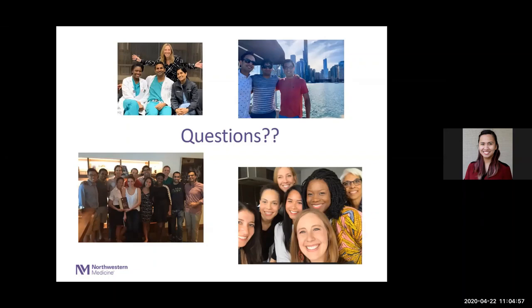And a couple of questions involved defining certain numbers and values, which is always a little bit tricky. One of them was, what do you define as urinary retention on urodynamics? And is that different for men and women? Well, in my mind, there's a difference between incomplete emptying and urinary retention, right? To me, urinary retention means they can't pee at all. If that happens only during urodynamics, they don't have urinary retention. They just are at a study that's really uncomfortable and they can't pee.